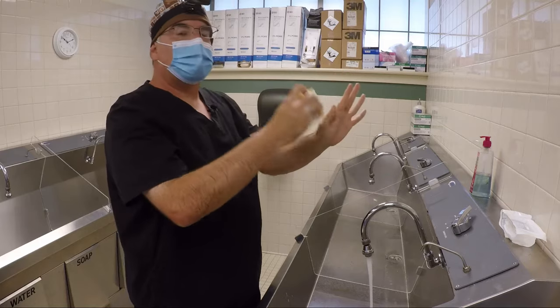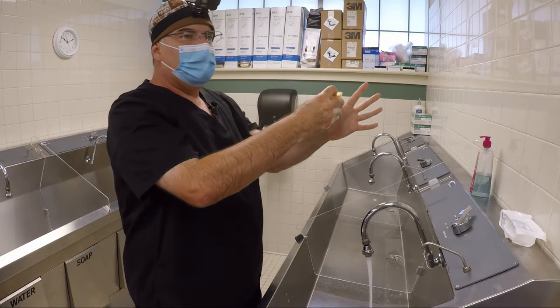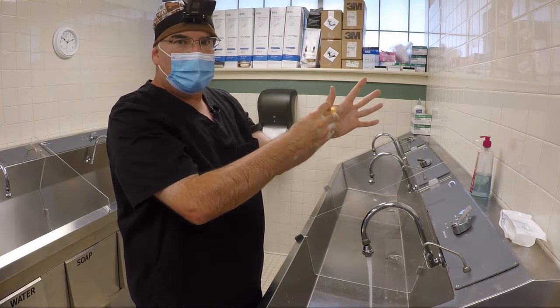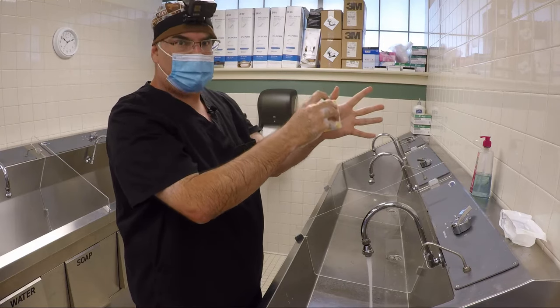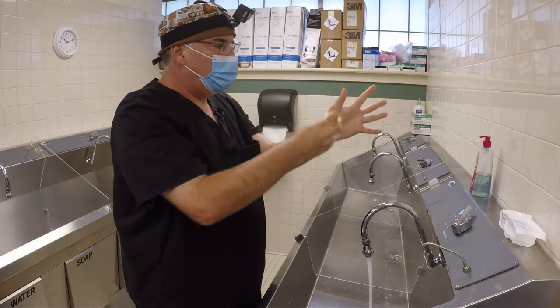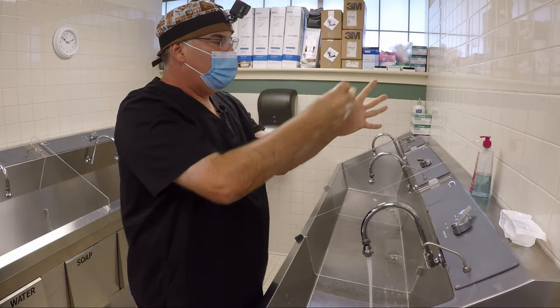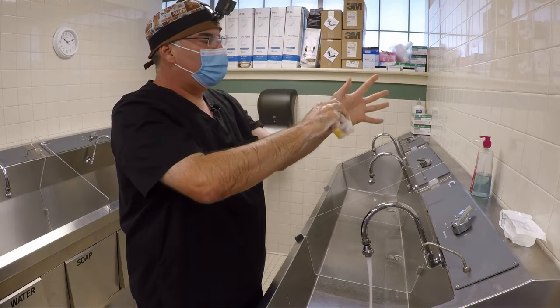All right. So we're going to scrub each of those individually. We're going to do it 10 or 20 times, 20 strokes or 10 cycles, right? The brush is going to pass over that spot 20 times, but we're going to do it in cycles. 1, 2, 3, 4, 5, 6, 7, 8, 9, 10. Now we've done this one side.